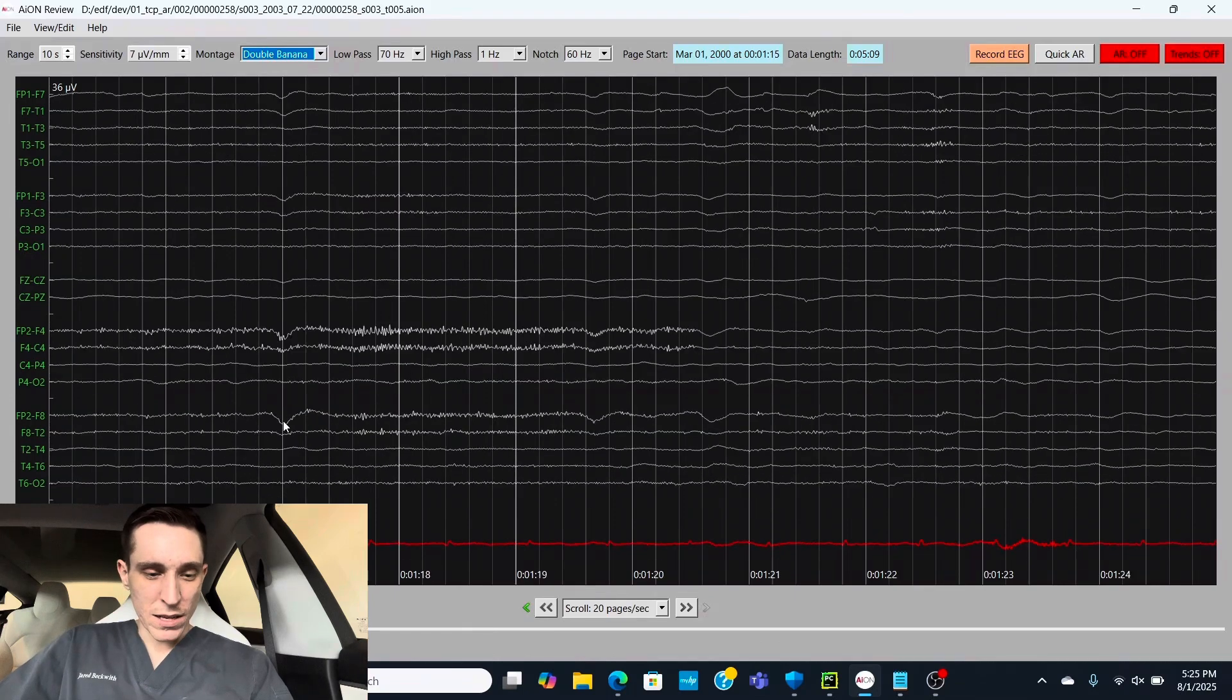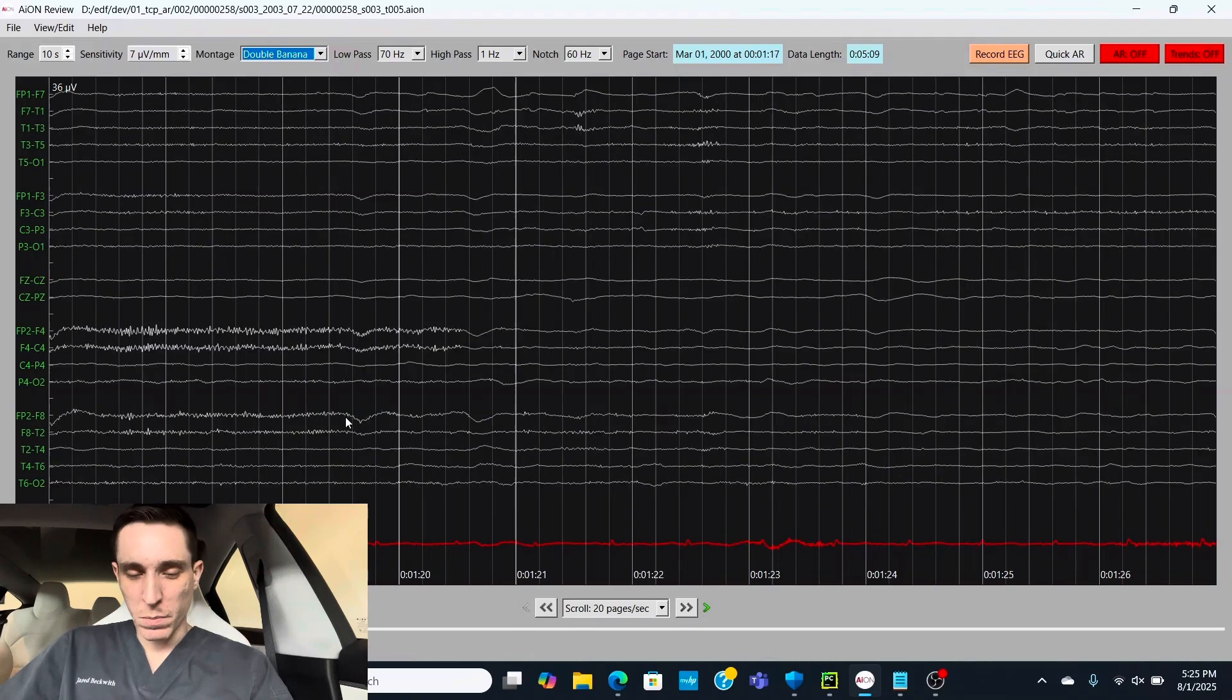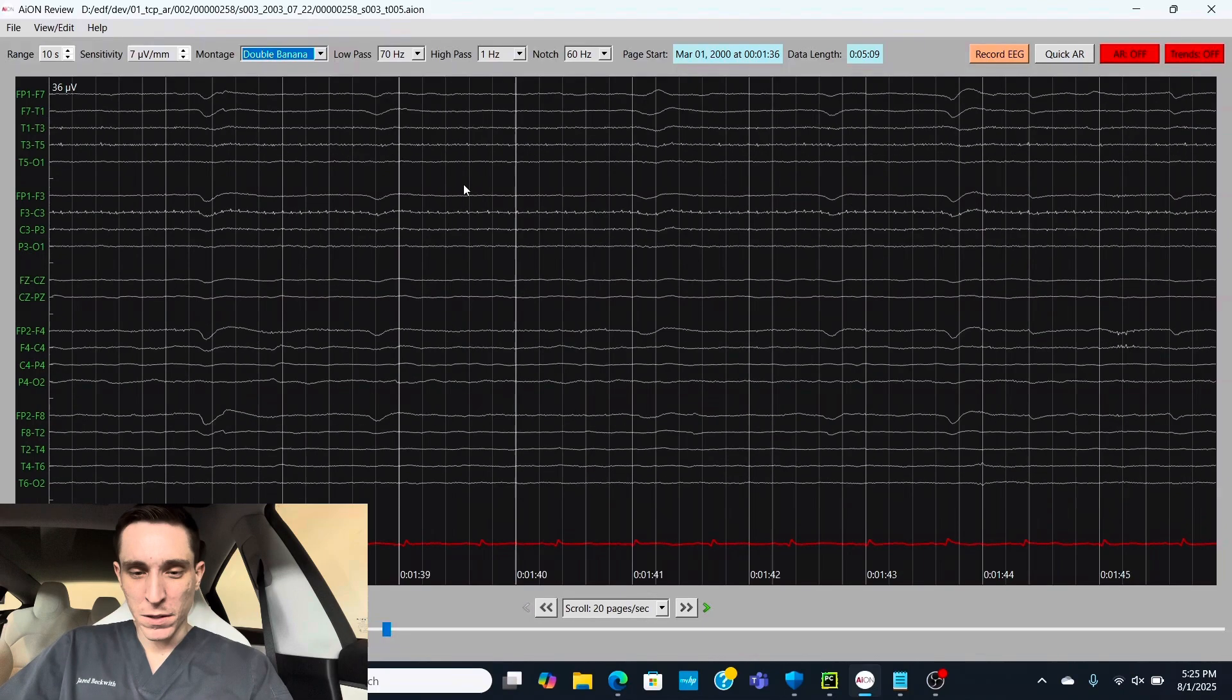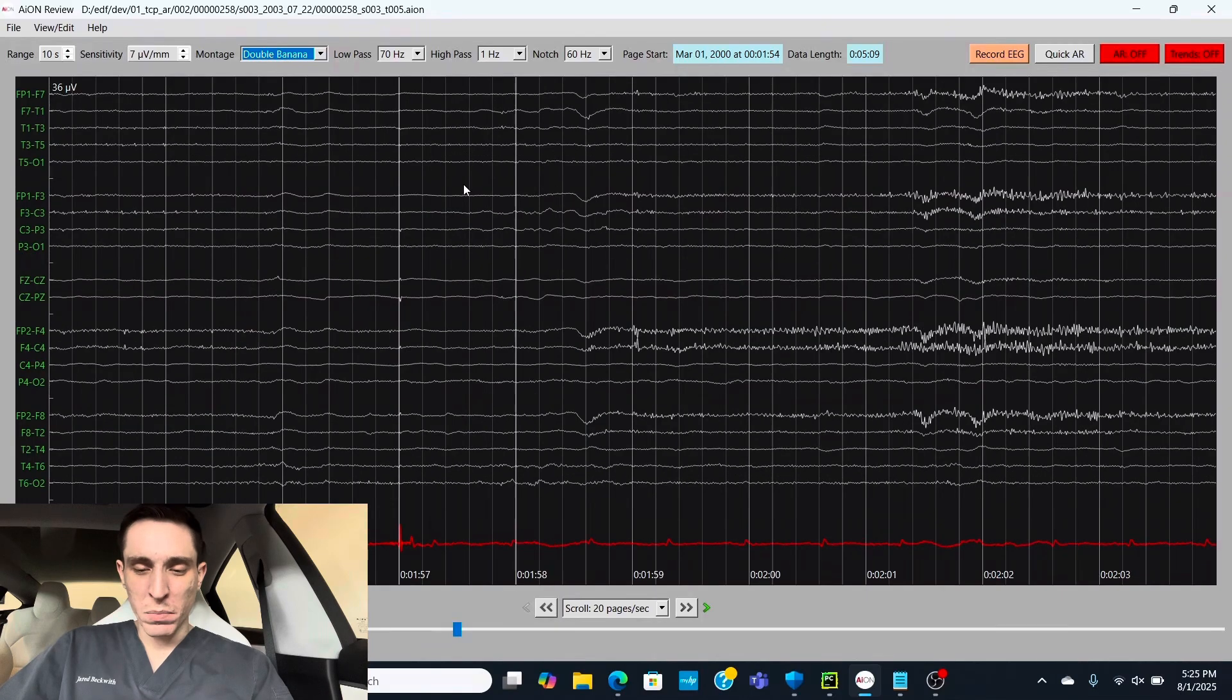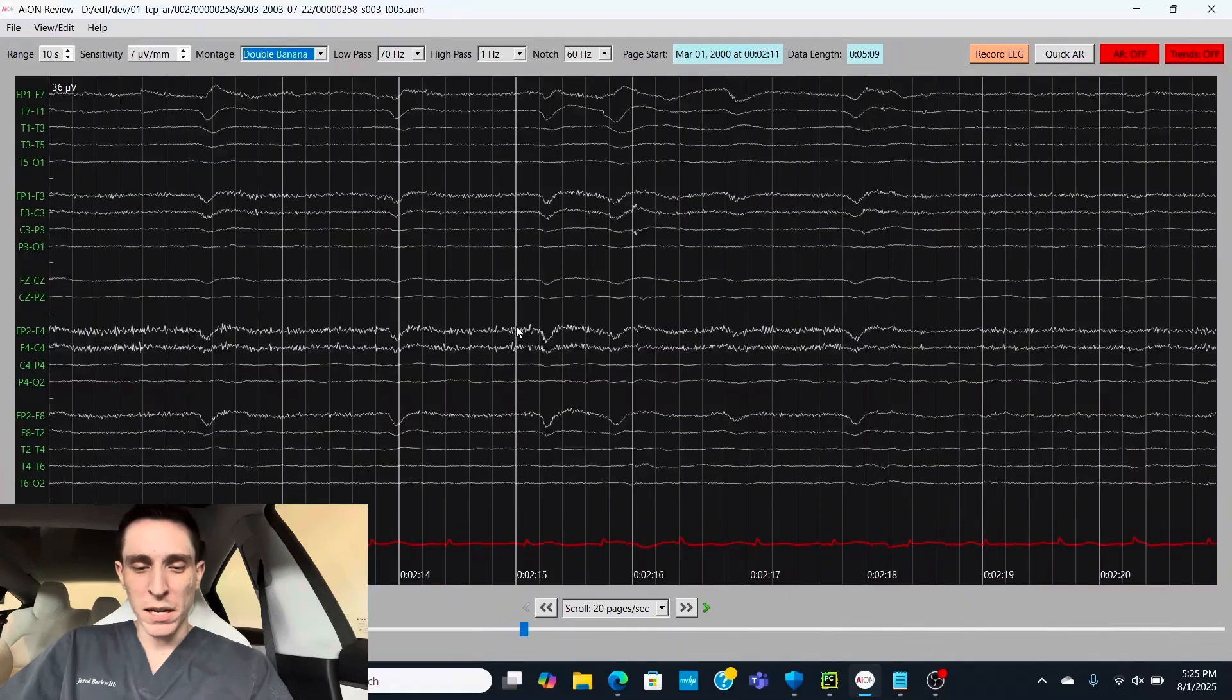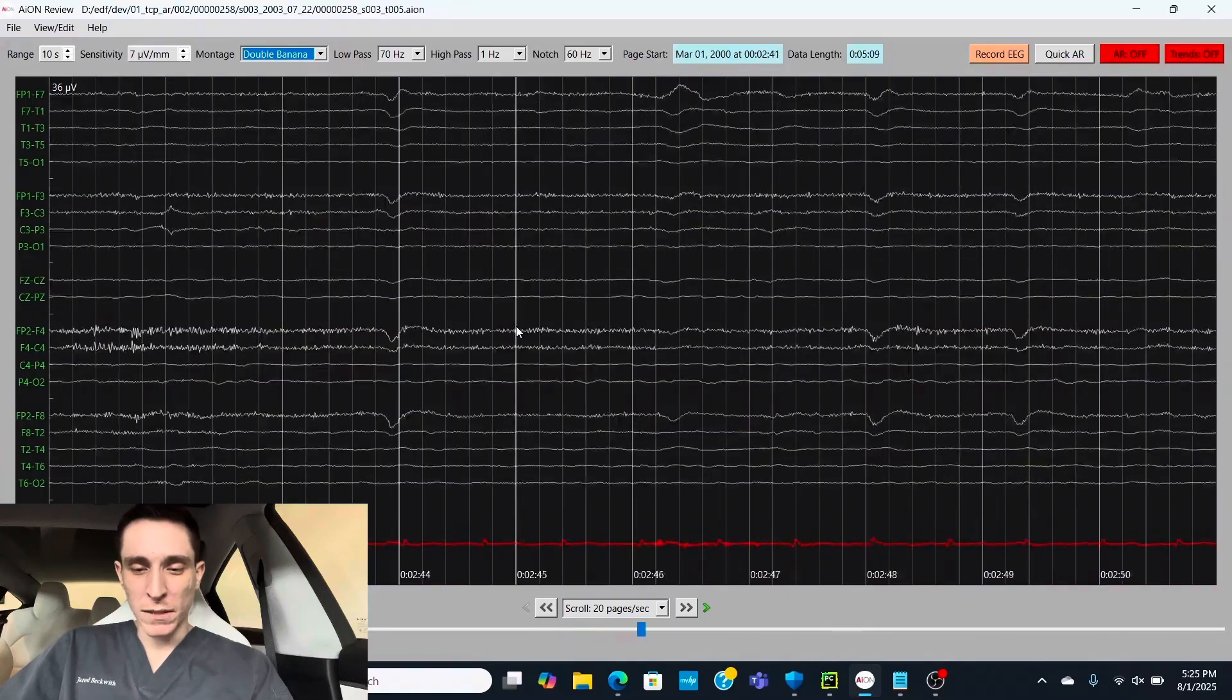Now, these movements in the frontal leads, that's most likely some eye movements from the patient. As we scroll on, yep, looks like eye blink type movement. And the patient must be pretty relaxed, maybe a little tension in their forehead. But otherwise, pretty relaxed laying in bed, most likely.